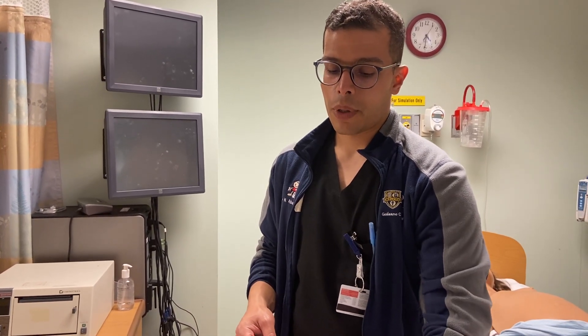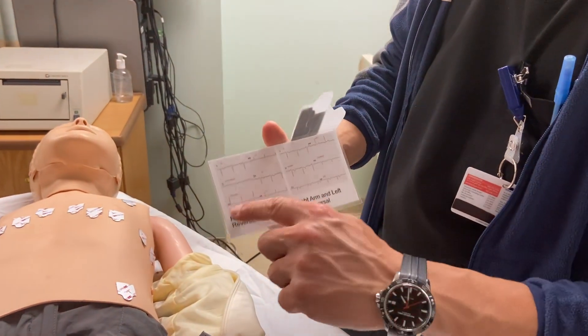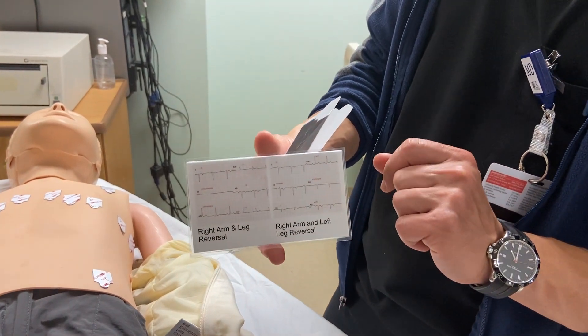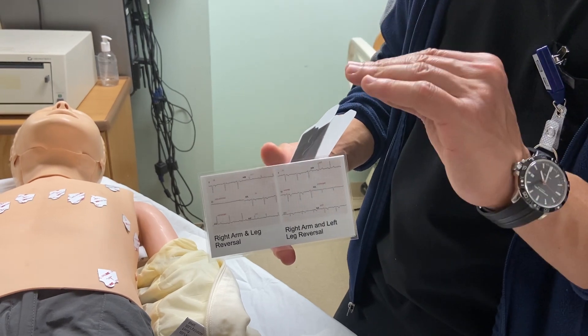Always remember, if you see an isoelectric line — a flat line on the EKG — that always suggests limb lead reversal. Double check your lead placement and double check where the leads are connected at the cable junction box. Thank you guys.